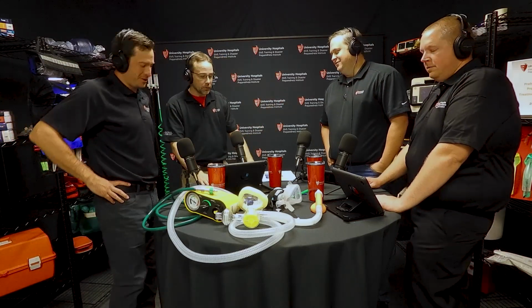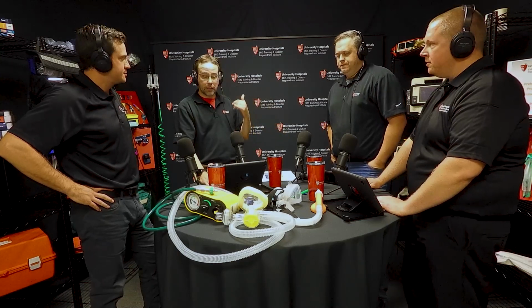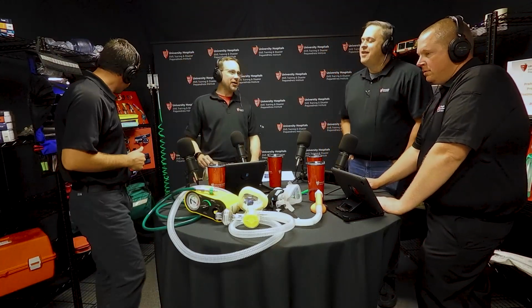But I think that mindset is like, oh, I'm putting them on a ventilator. It's still not a ventilator. DNR does not mean do not treat. Exactly. It's do not resuscitate. Correct. And supplying constant pressure, it's not a ventilator. There's not in and out, right? It's just strictly in, thus it doesn't meet any criterion for ventilation. Now, I will give a caveat that if we're talking about the hospital BiPAPs, I have a backup rate that I can do, and you could consider it. It is tricky and gray, but it's not what we're going to talk about in the pre-hospital setting. Correct. Certainly no backup rate on here. The backup rate on these devices is 0.